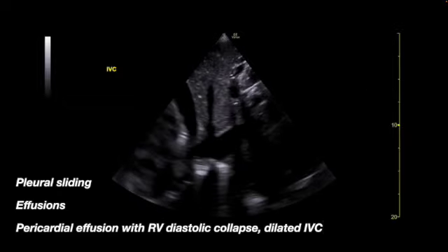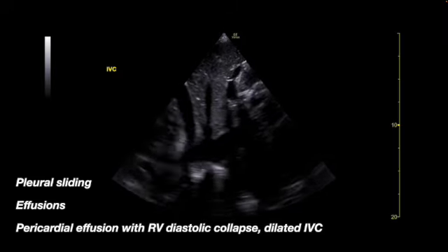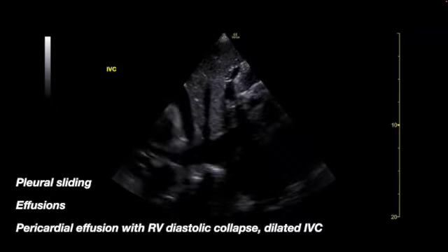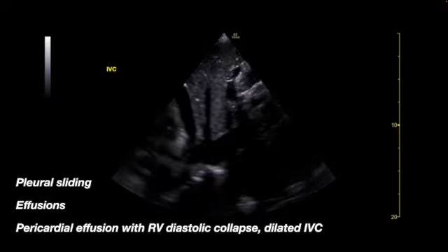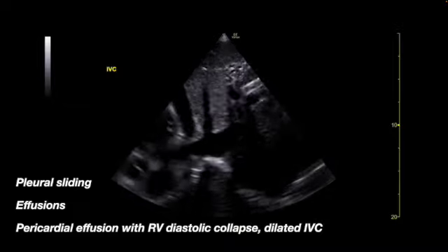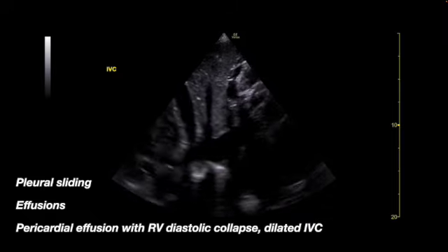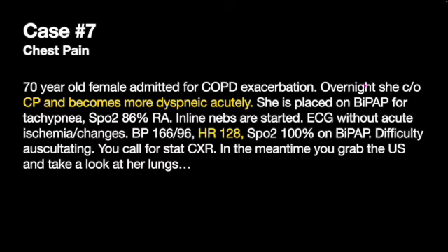So again, this patient with lupus, not taking her meds, bunch of other medical issues, coming in with chest pain. You know, she had bilateral effusions, indicative of fluid in her lungs. She had no signs of pneumothorax, so you had a reason for her to be dyspneic, but you didn't have a reason for her to be hypotensive. You noted that on your cardiac exam, she had fluid around the heart, and when you performed your M mode evaluation, she had right ventricular diastolic collapse, indicative of cardiac tamponade. You called CT surgery, they took her to the OR. This is a great example of how point-of-care ultrasound can really expedite patient care.